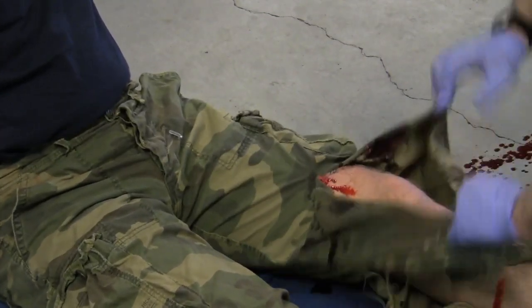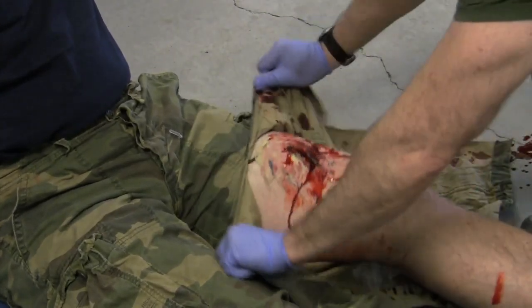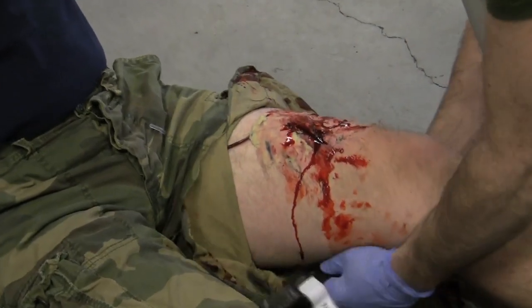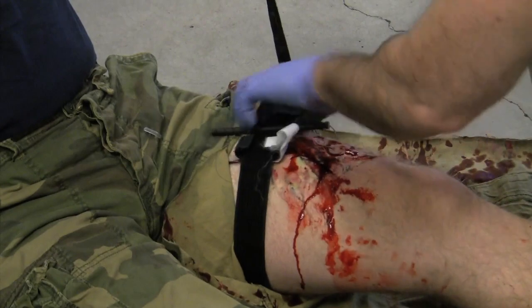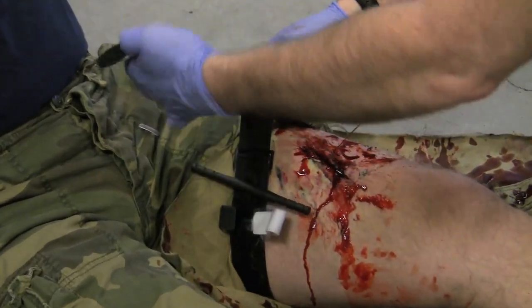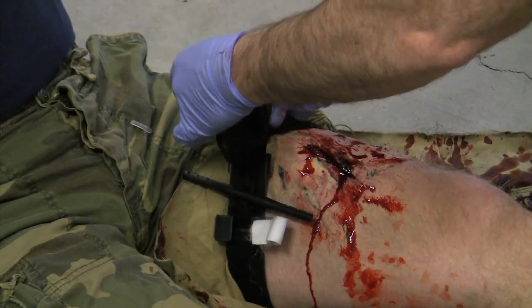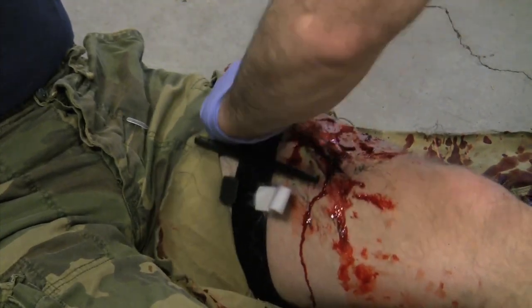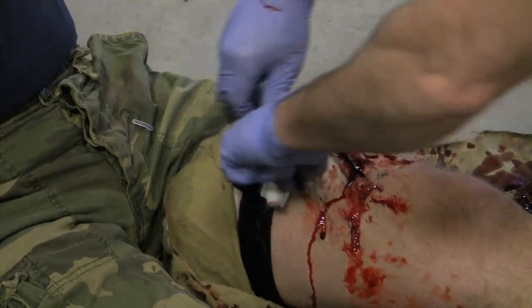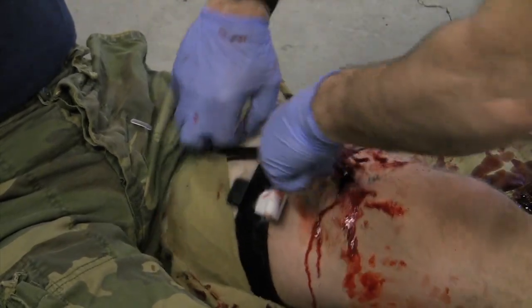Try to find the source of bleeding and place the tourniquet around the wounded extremity. Ideally, this should be placed 2 inches above the wound. Make sure to use both slots of the buckle when applying to a lower extremity. Once the strap is through the buckle, adhere the strap onto itself. Then twist the windlass rod until bleeding has stopped. Lock the rod in place by using the windlass clip.